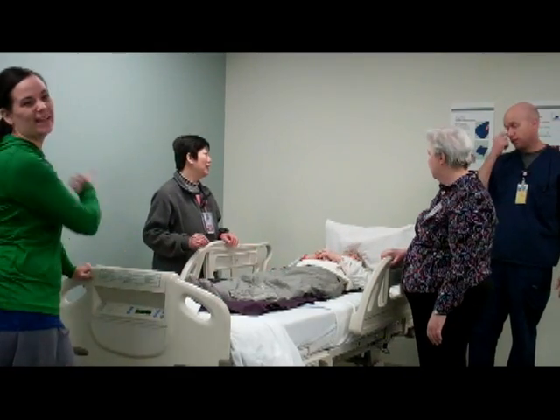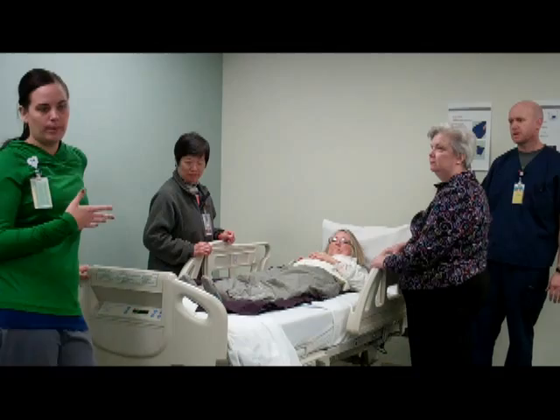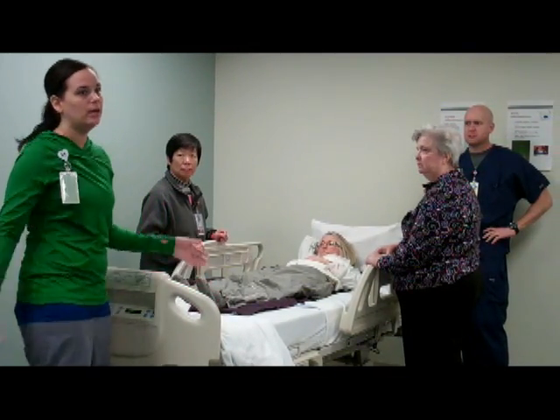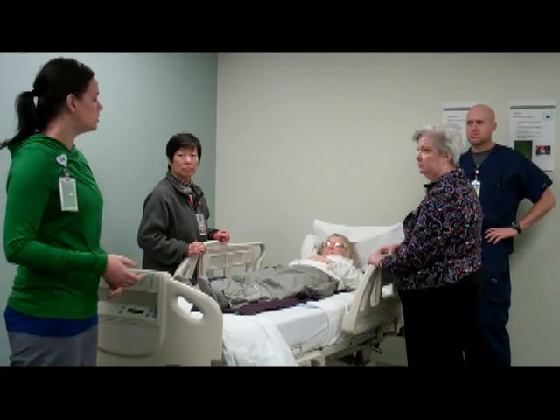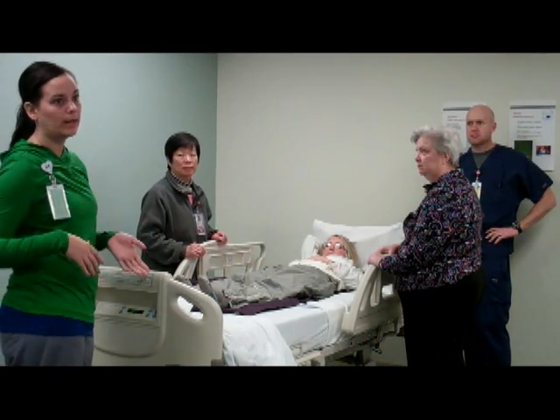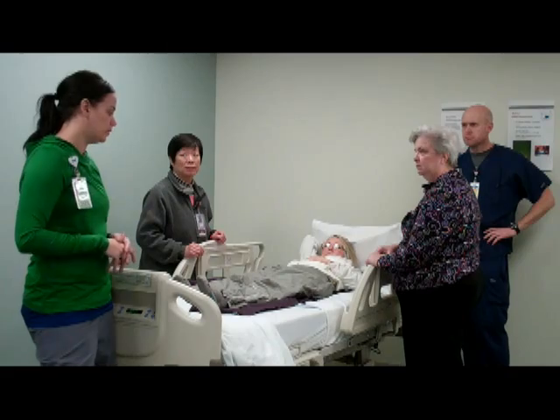Once you get her flat, then you'd have to roll her and get her out. That's the only inconvenient part of these, the green one and the two slides that we have here. They don't stay under the patient. They're not breathable. So for the people that you find you're constantly boosting, this is just another tool in your tool bag if you want a way to boost and reposition people.